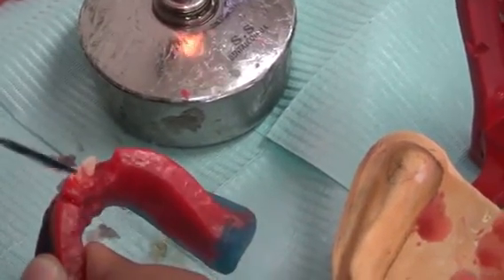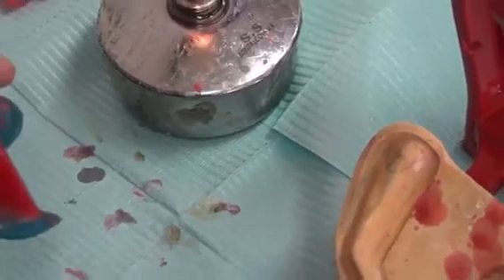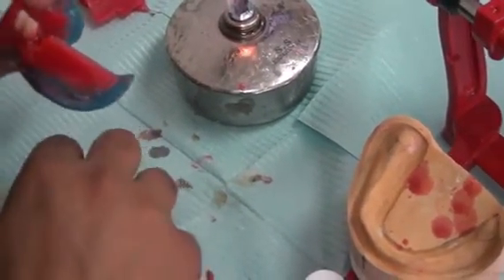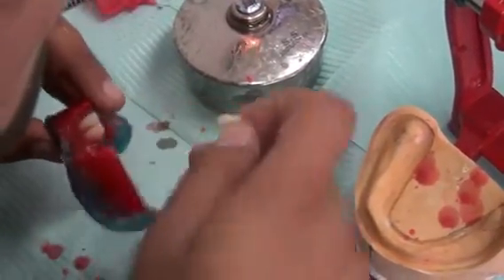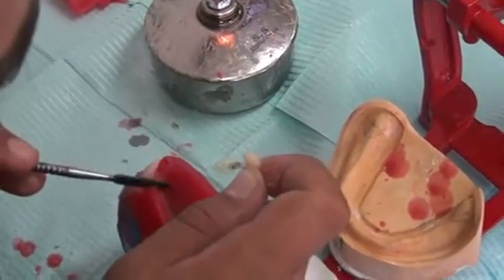And it's important here to have the teeth fixed into location, because lower teeth are thin and they can easily move in wax. So sometimes you are aiming to add one tooth, but you end up moving the other teeth after you have already added.